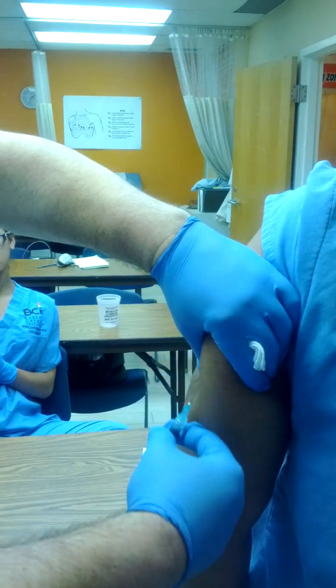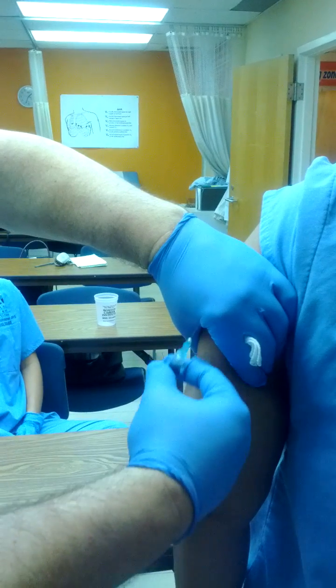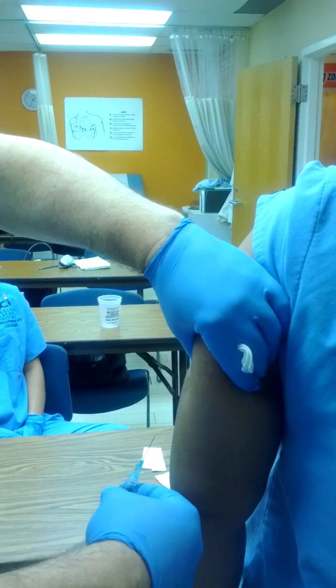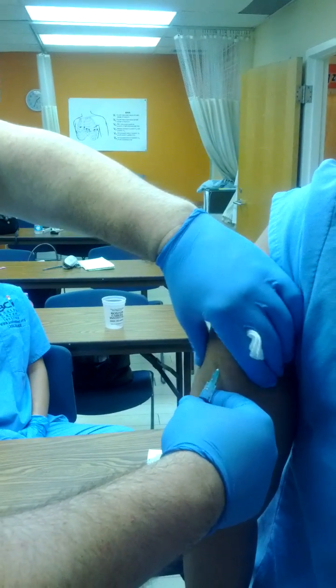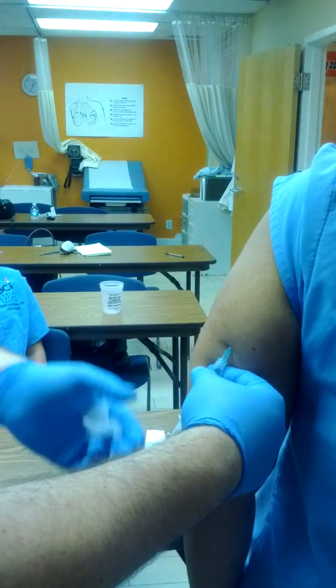This bulge is already forming like a 45-degree angle between the rest of the arm and itself, so you can see how there's an angle. All I'm going to do is go straight into this bulge like this. She's not going to feel anything, and the needle goes all the way in. I let go of my left hand — the right hand is married to the needle. It does not move.